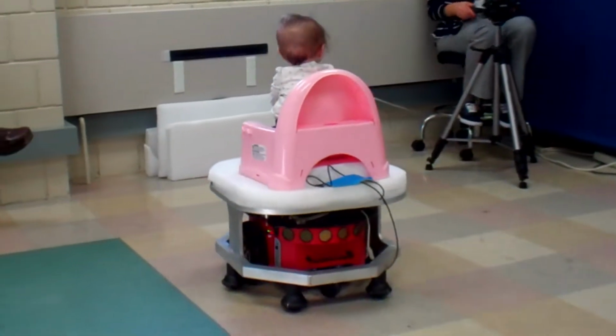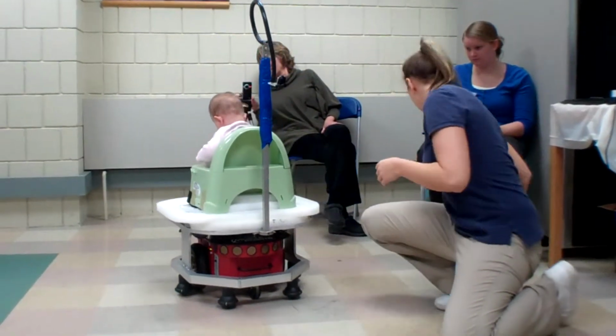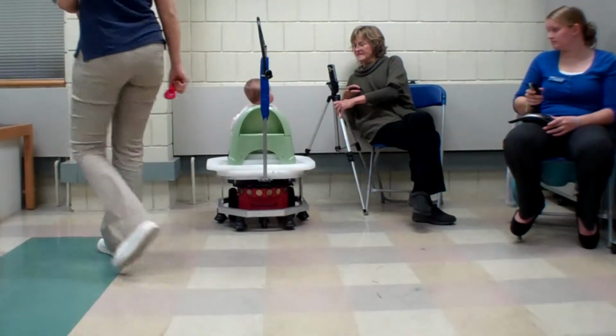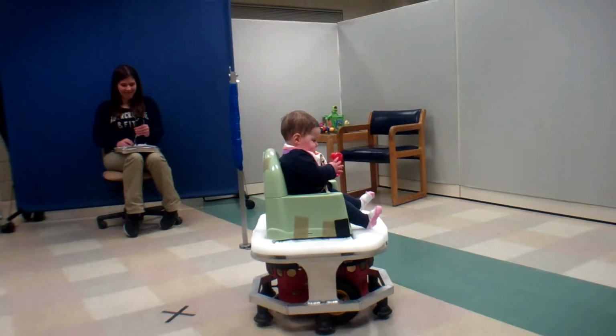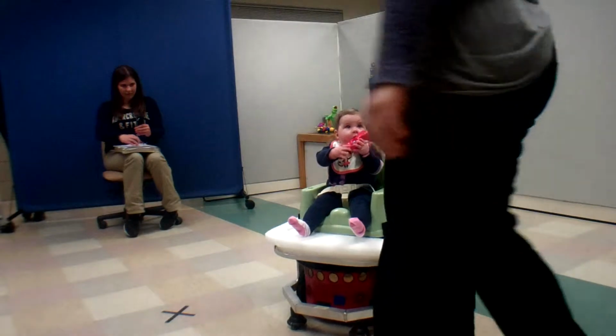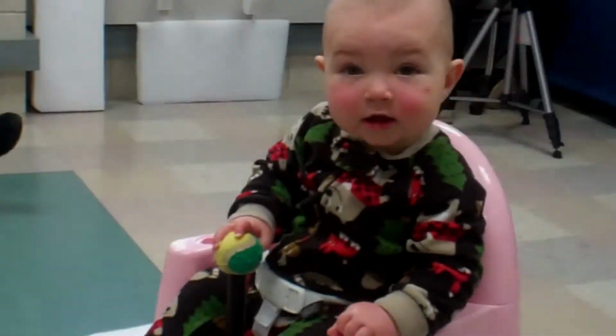We have 2 free play sessions that are each 3 minutes, and between the 2 we have a 10-minute training period that we call driver training. Babies are given 9 trials to get to objects, and the objects are placed 6 inches, 12 inches, and 3 feet away from the babies, right in front of them, to the left of them, and to the right of them. We look at how many of those 9 trials they are successful in getting to the toy. We wanted to compare how quickly babies could learn and what they did when they were able to explore on their own with those 2 different kinds of controls.